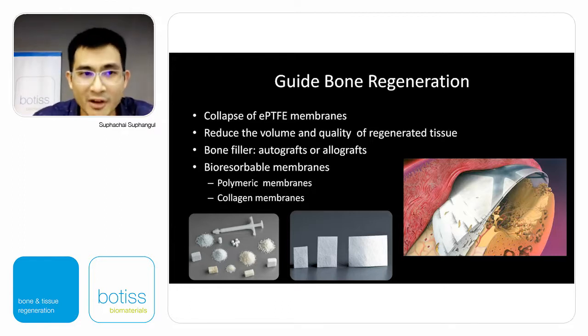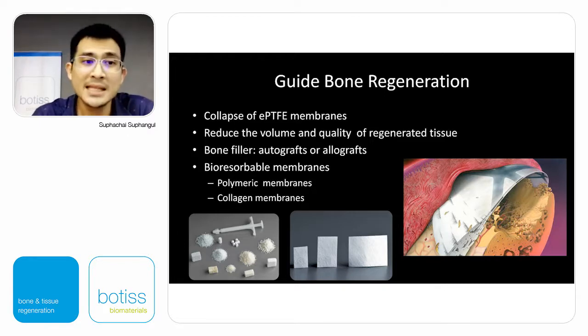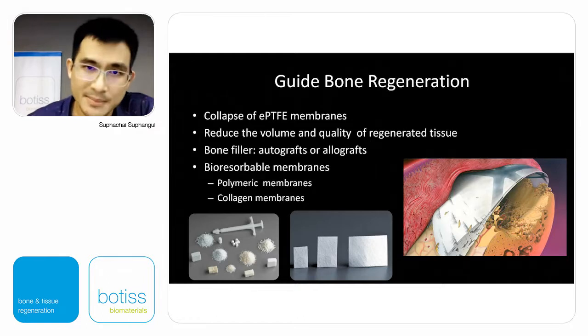For the membrane itself, at first we used the non-resorbable one, but after that they had the problem of dehiscence of the wound. That's why they developed the bioresorbable membrane. It could be a polymer or a natural collagen membrane.